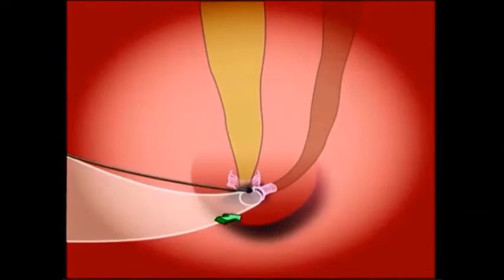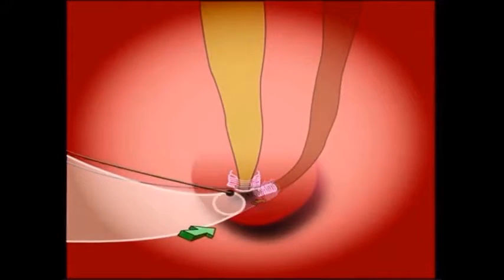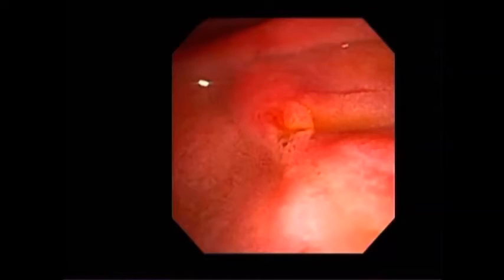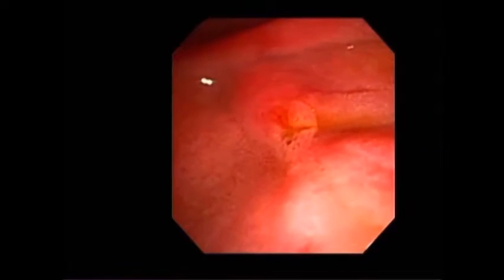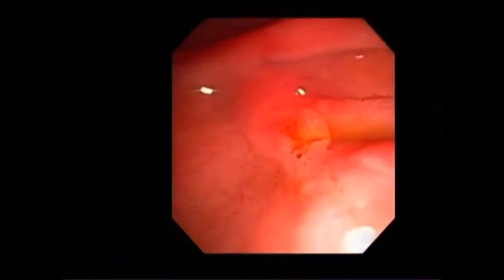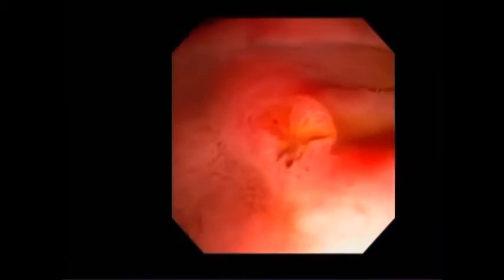Performing pancreatic sphincterotomies to cut only the superficial sphincter fibers along the septum rather than a deep cut into the pancreatic parenchyma. This is a patient with severe right upper quadrant pain that is exacerbated by PO intake. Endoscopic ultrasound showed only 3 out of 9 criteria for chronic pancreatitis, which is non-diagnostic, and liver and pancreatic enzymes were normal. She is suspected of sphincter of Oddi dysfunction type 3.